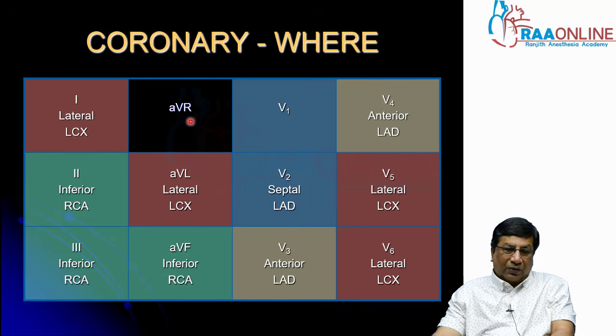To locate a coronary artery, we have seen the group of leads. We already know that. But to see in which portion of that particular coronary artery the obstruction lies, we have to look at two important leads we hardly look at in our day-to-day practice, which are aVR and V1. These two leads give you information about the localization of the lesion in a particular coronary artery.